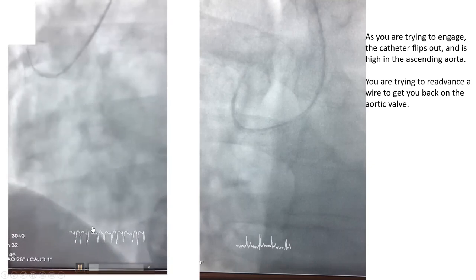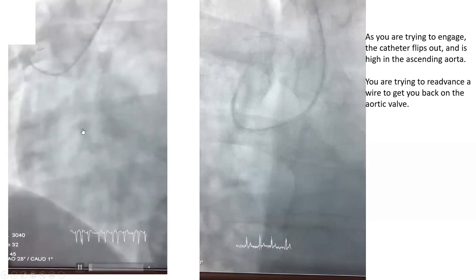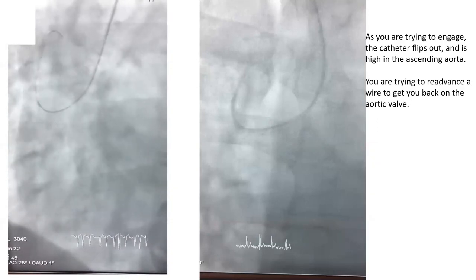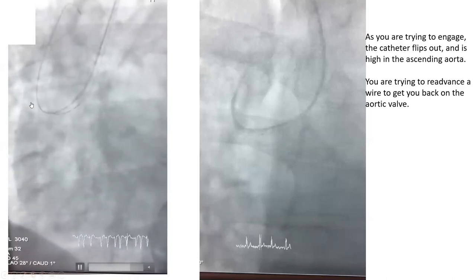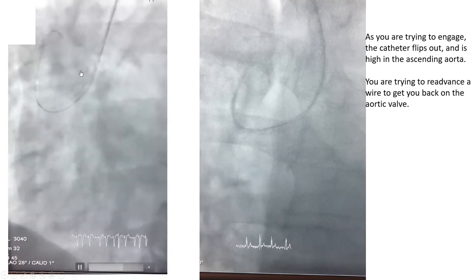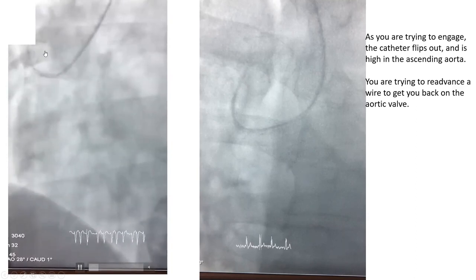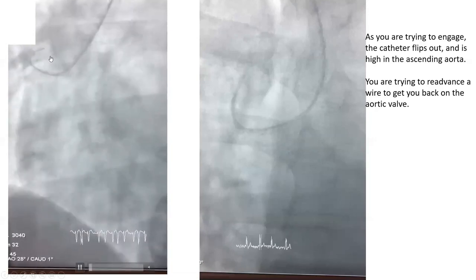So the fellow is trying to advance the wire — this is actually a common mistake. They advance the wire and keep pushing it, expecting it will reach the aortic valve. It's not going to reach the aortic valve. Why? Because that catheter, the way it's shaped now, is pointing the wire all the way up. So you keep pushing it and pushing it, hoping it will fall — it's not going to fall. The catheter is pointing you up.